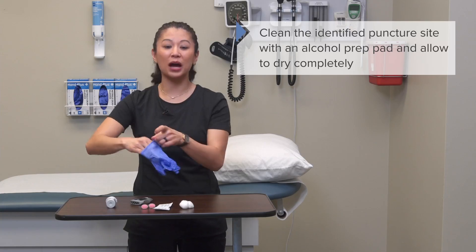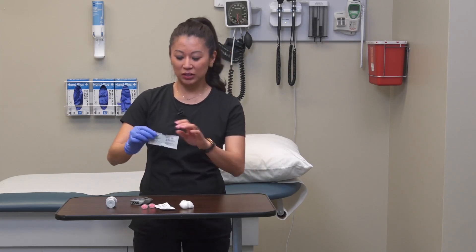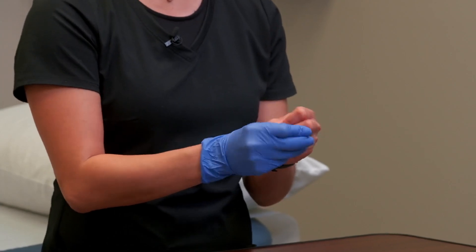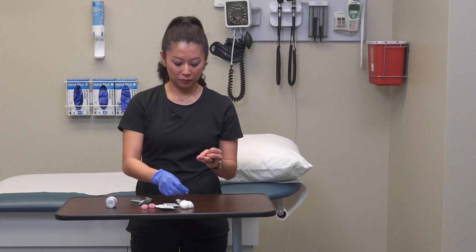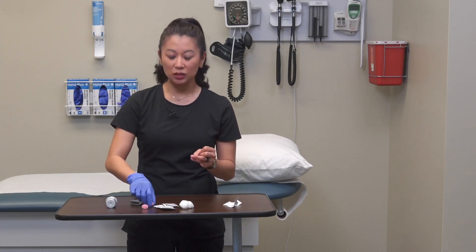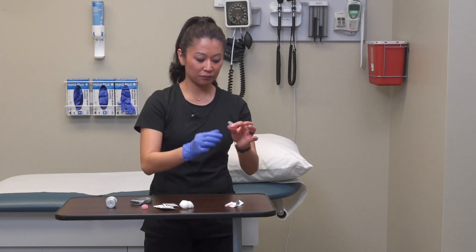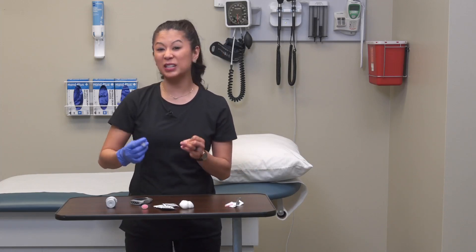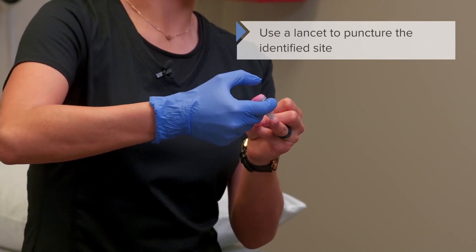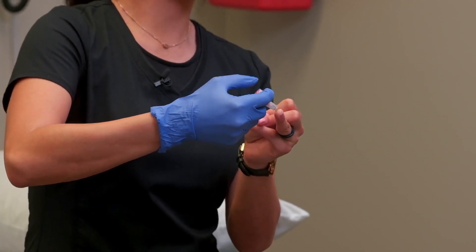Now that the test strip is ready, clean the site with an alcohol pad. In the hospital you would be wearing gloves. Clean the puncture site thoroughly with the alcohol pad and allow it to completely air dry. Each facility uses a slightly different lancet, so get familiar with yours. For this lancet, I'll remove the stopper, then push the lancet toward the pad of the finger with light pressure, and push down the top.